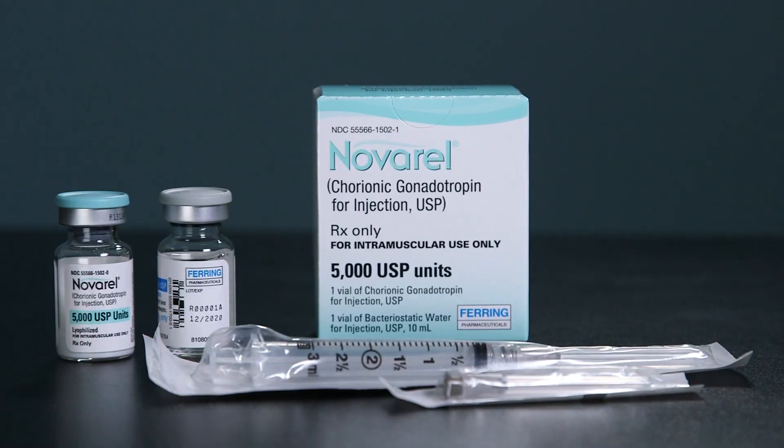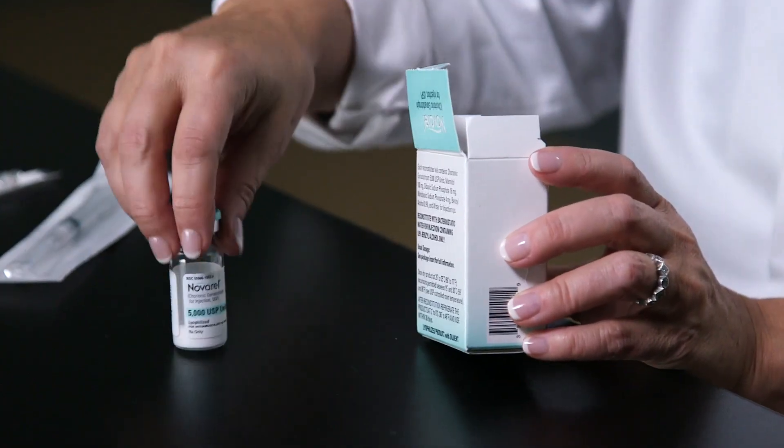Novarel is a room temperature medication. It should be injected shortly after reconstitution, but it can be stored in the refrigerator for up to 30 days.